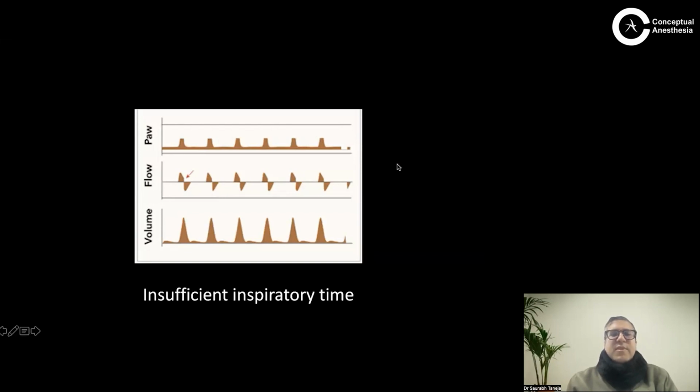So there is insufficient inspiratory time. Expiration starts, the inspiration time is too short. Even the inspiratory waveform is not touching the baseline. Yes, no inspiratory pause or less inspiratory time. Great, Dr. Manimaran. So here the inspiratory time is short. It does not touch the baseline. You have to prolong the inspiratory time, and you have lots of time at your hands. So this is the flow waveform, and seeing this, you can change the respiratory rate and the inspiratory and the expiratory time.